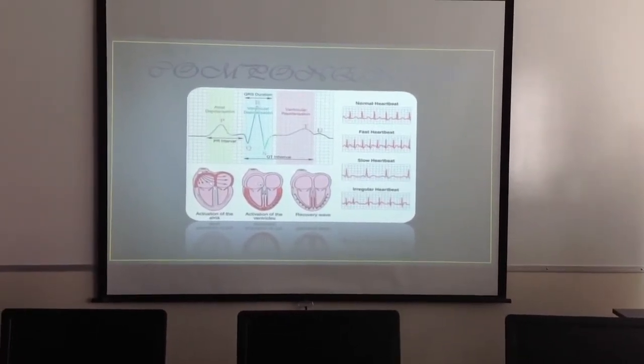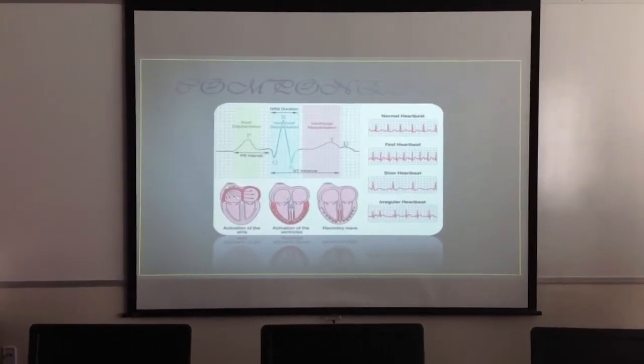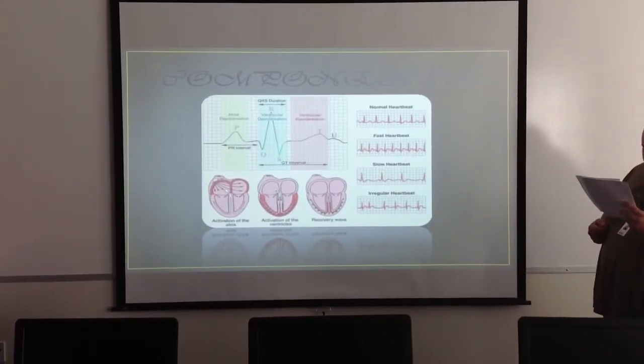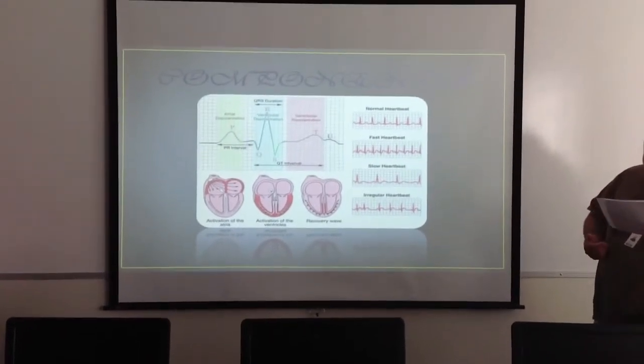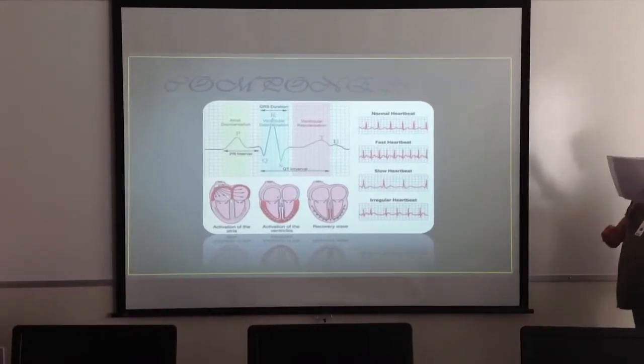Not always noticed, but still present, mainly on the right precordial leads, V2 and V3, is the U wave. There is much speculation on the U wave, but many agree that they occur as afterdepolarizations in the ventricles and/or repolarization of the Purkinje fiber.